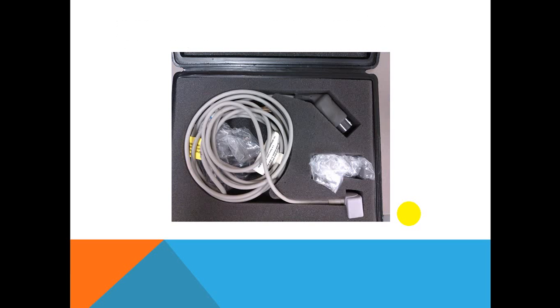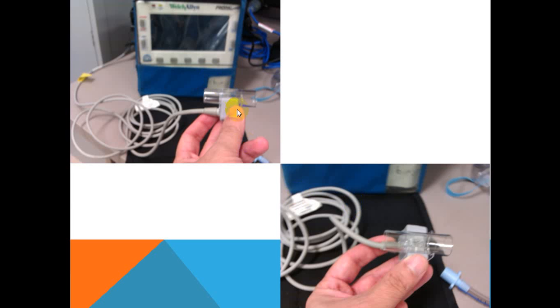It connects to a Welch-Allyn ProPack, which I'll show you, and the sensor device is actually this component here. You see I've taken it out there. It's got a disposable endotracheal tube adapter that you plug into there, and it plugs into your Welch-Allyn ProPack device. You can see that an endotracheal tube is fitted onto the end of the device, and then the rest will go into your bag valve mask or your ventilator circuit.